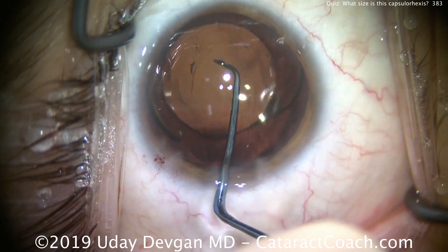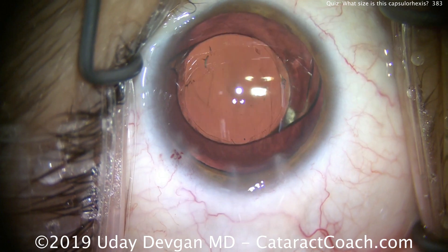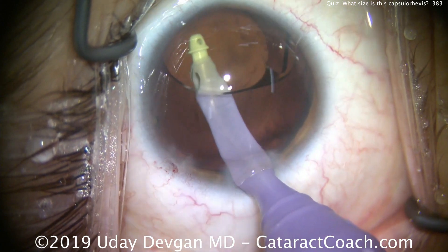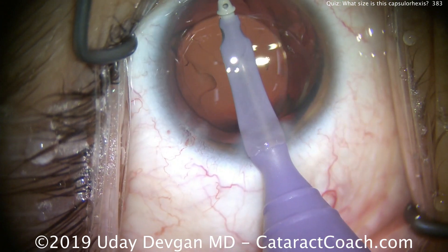This is a very myopic patient. The IOL going into the eye is a power of only 8 diopters, meaning this patient probably had about minus 10 diopters of preoperative myopia — a larger myopic eye.